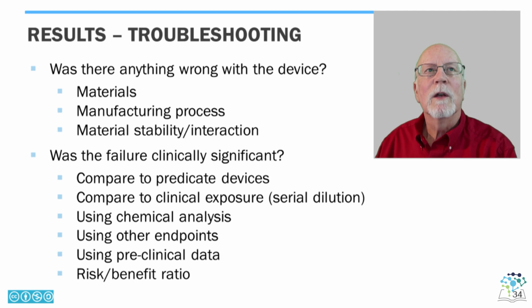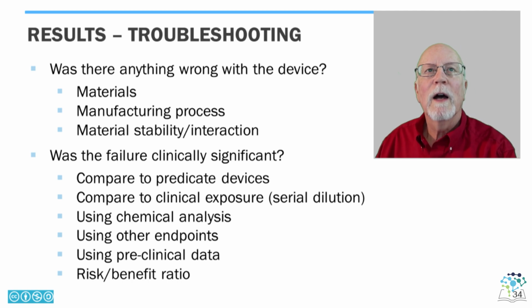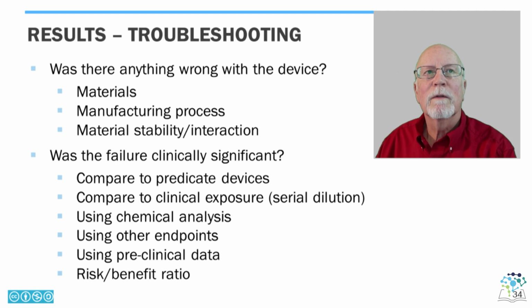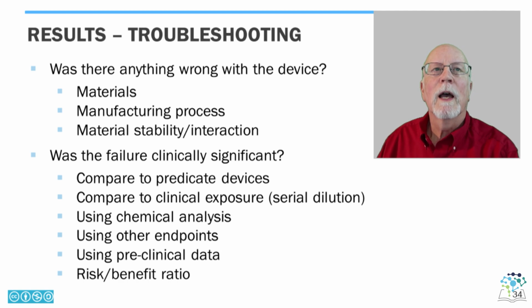Occasionally, the failures can be attributed to the manufacturer. For example, a wrong batch was slipped into the testing stream, or a material may not have been exactly as represented by a vendor. A great place for discussing failed test results is in the area of clinical significance. Conditions specific for the device and its utilization can sometimes allow a failed test to not delay a submission. Again, this requires a good regulatory team at the testing laboratory and a lot of experience in dealing with regulators.